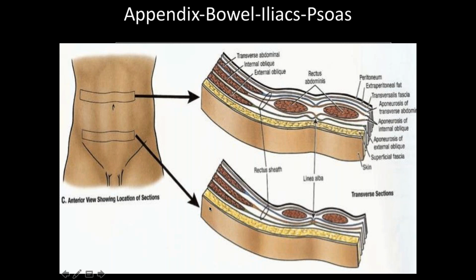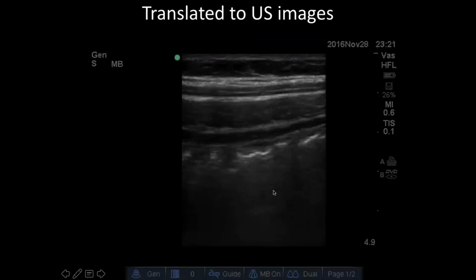Now, as we go from right lateral to medial, you will see that there's an aponeurosis that goes around and wraps around the rectus abdominis muscle, which we'll also usually see, and I'll point that out to you in some of the ultrasound scans when you're looking for the appendix, how close the rectus abdominis is to the peritoneal lining, and further down you can usually see bowel underneath that peritoneal lining.